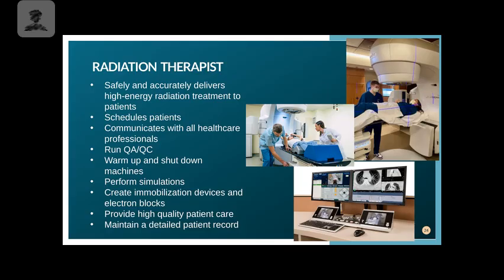We do our daily treatments on our linear accelerator, but we also use our CT machine for simulations. And so we'll have to do warm up procedures and shut down the machines, do any kind of checks daily on those. We have to perform the simulations in CT. So we will take a break from the linear accelerator and go over to our simulation and do that whole process, get their immobilization devices created, electron blocks if they need to. We can get them completely set up and things organized for their first day of treatment.